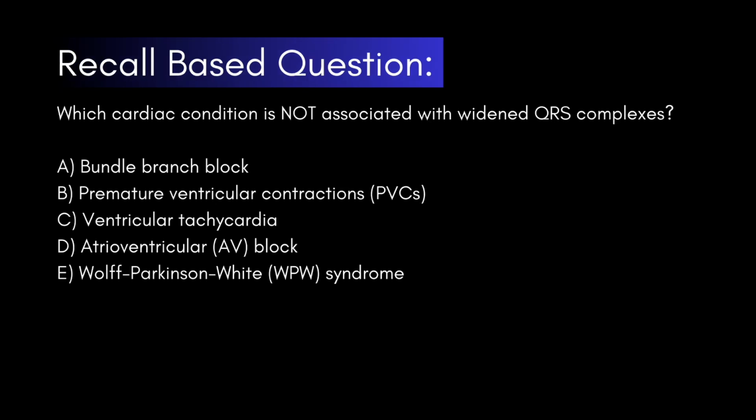Which cardiac condition is not associated with widened QRS complexes?